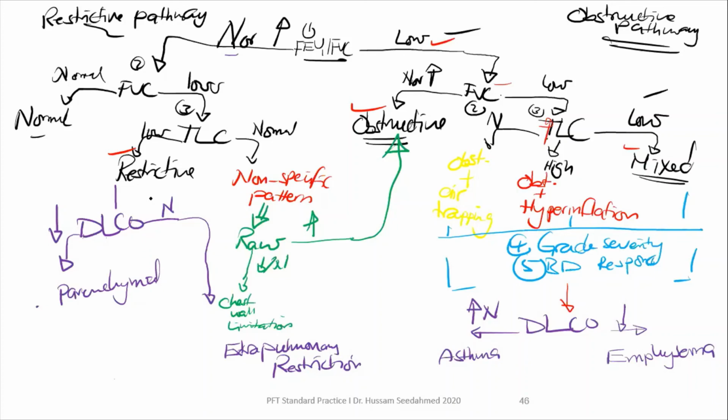طيب أنا ممكن patient يجيني normal، اللي هي إذا بريت this pathway normal FVC. إذا أنا عملت للبيشنت ده الدلكو، برضو عندي two possibilities. الدلكو ممكن يجيني normal which is this is normal. يعني أنا عندي normal والدلكو normal دي طوالي normal. لكن النورمال spirometry with decreased DLCO, what is the cause?